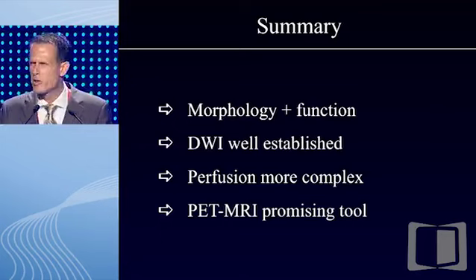DWI, ladies and gentlemen, is really well established. Again, force your radiologist to use it. Don't get frustrated if he tells you, no, I cannot do it. This is not true. Everyone can do DWI. Perfusion is definitely much more complex, and only dedicated centers with a high knowledge about it would use it. And I think in the future we're going to talk much more about hybrid imaging like PET MRI.